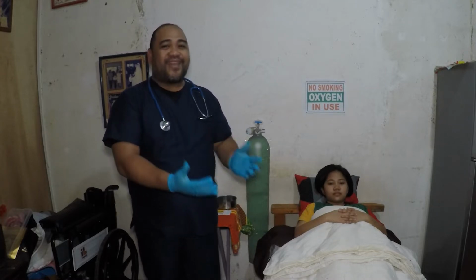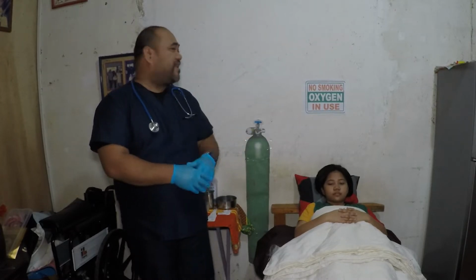We have to explain to the client the dangers of lighting matches or smoking cigarettes, cigars, pipes. Make sure also to keep safe any possible source of fire. Place a warning sign of oxygen or no smoking, and do not use oil on oxygen equipment. Oil is a real source that ignites fire. With all oxygen deliveries, make sure to turn it on first before the mask is applied. Make sure also to check that the tubing is working properly. Then maintain a constant oxygen concentration for the client to breathe.